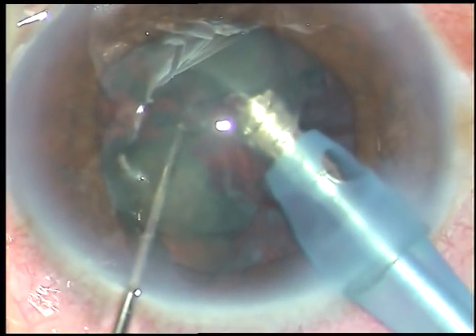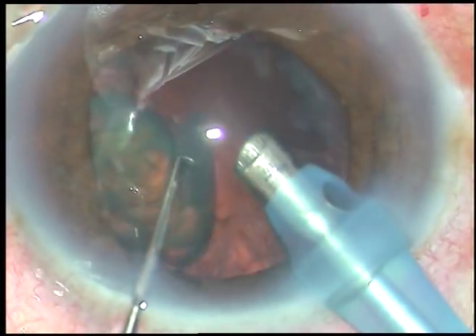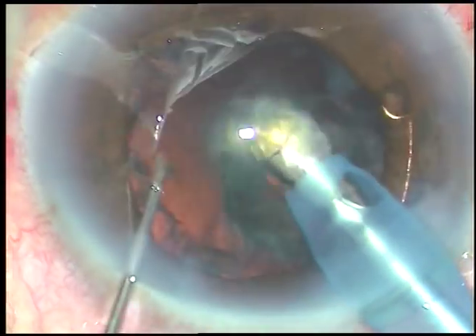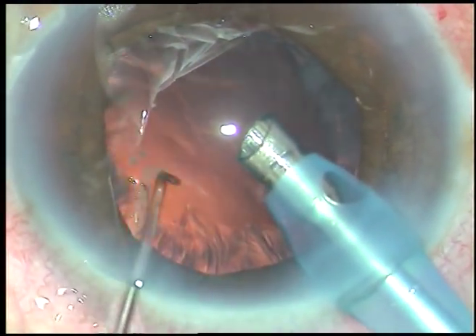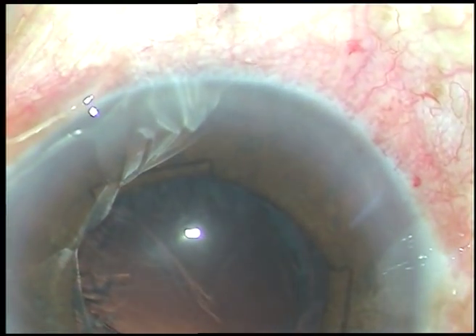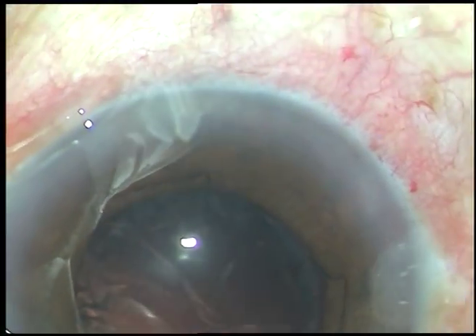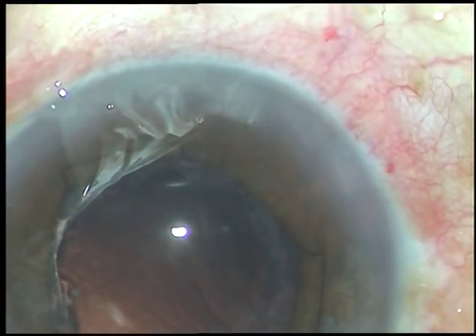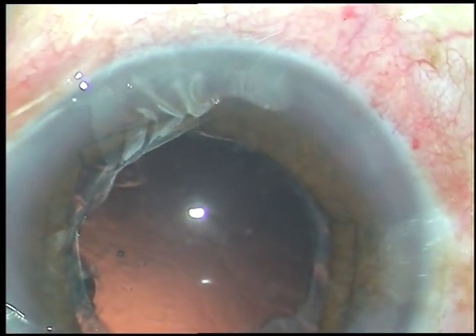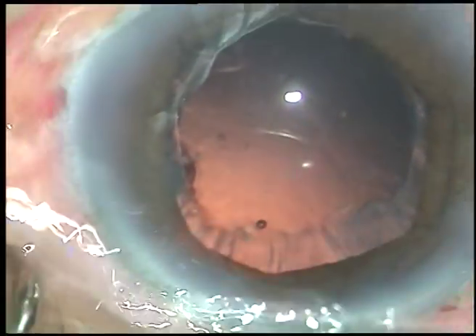The nucleus is almost managed. This is the last portion of the nucleus. And we can see very good red glow at this moment, and a fluff inferiorly just inferior to the center.